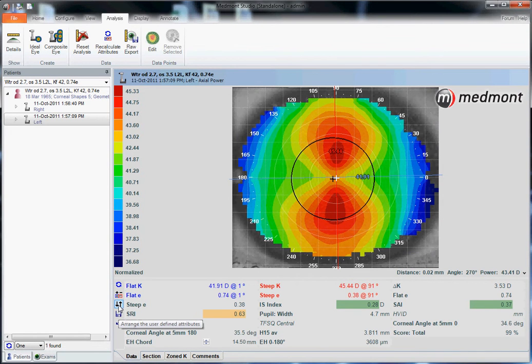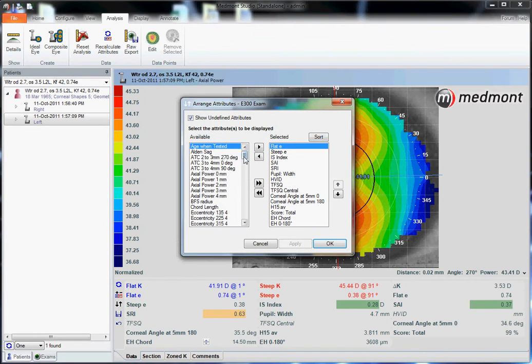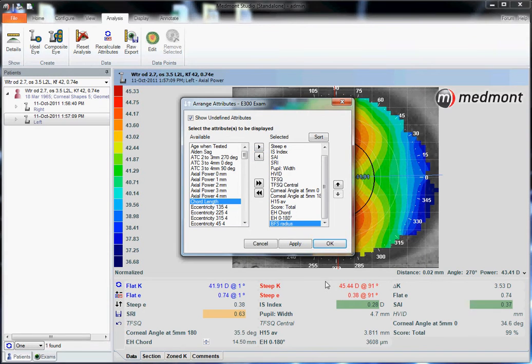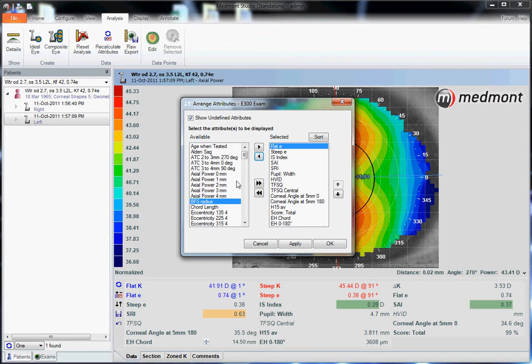If you go down to the Arrange icon, this allows you to move a specific attribute from the main database over to your active window on the bottom. You could click on an attribute and use the arrow key to move it across, or if you want to eliminate an attribute that's on your window, select it and again use the arrow key to move it back to the main database. Whatever is on the right-hand side will appear on the bottom of your window.